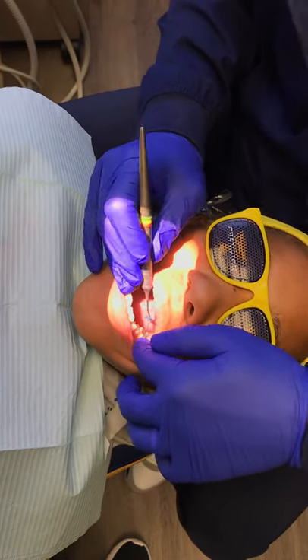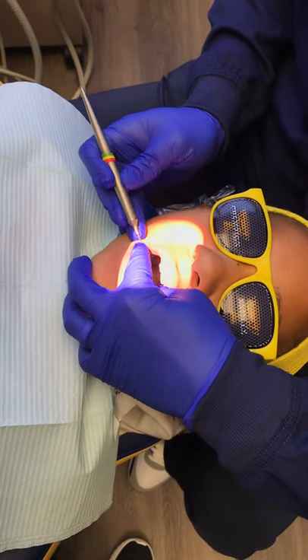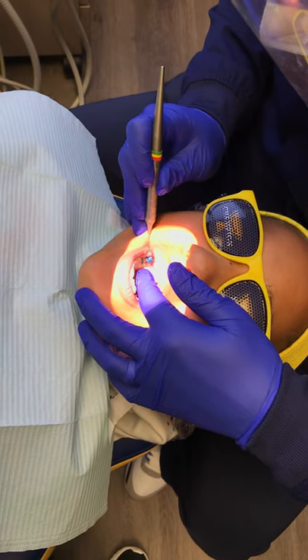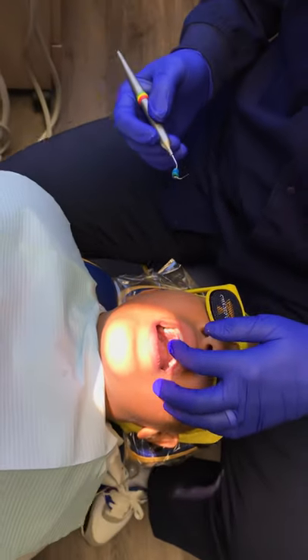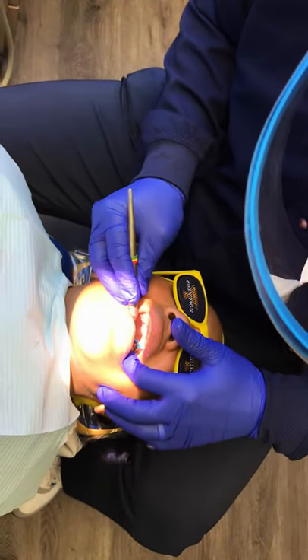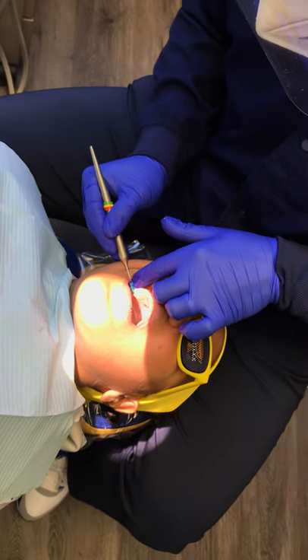So we're going to remove the separators. You can take an explorer or a scaler. If they've been in for a few days and they've done their job, then the separator should come out pretty easily, as you can see. Just a little bit of gentle pressure upward. Tip your head back and adjust your chair.